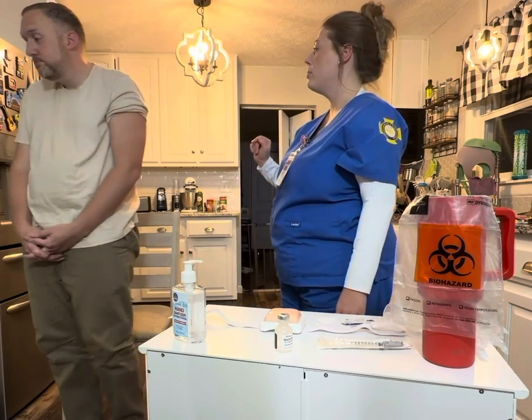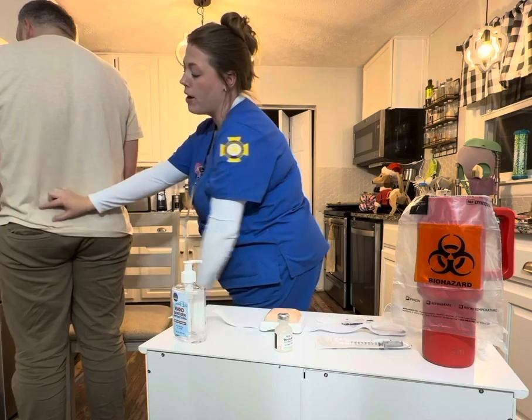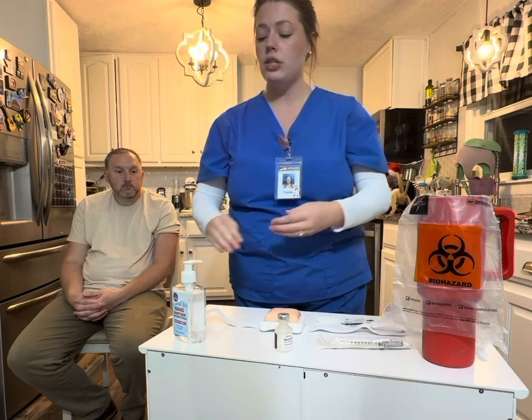You go ahead and turn around for me. You can give it in the back area, and then you can also give it in this upper ventral gluteal area right here. You can go ahead and have a seat for me. So next I will go ahead and demonstrate on my injection pad how I would give a subcutaneous injection.